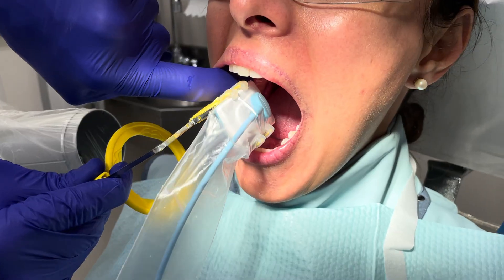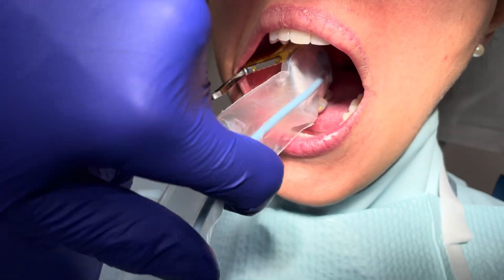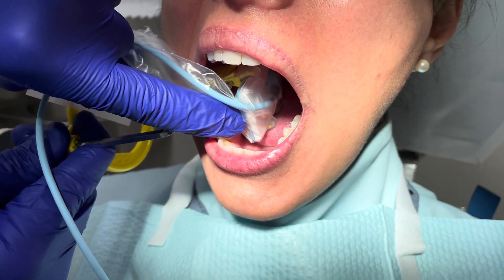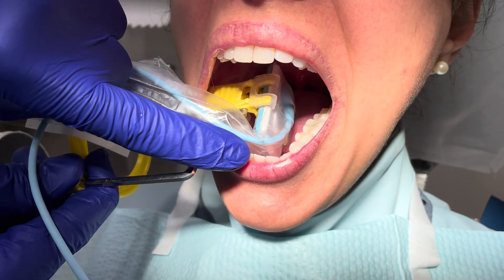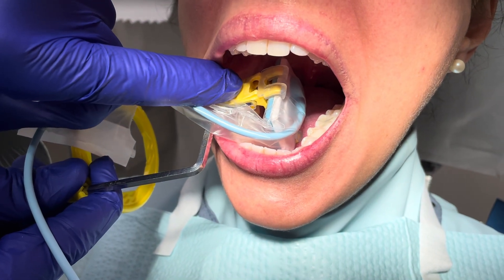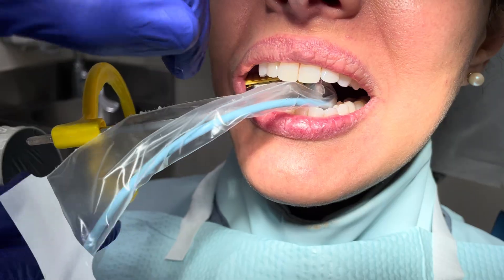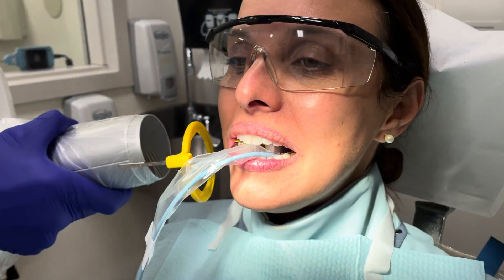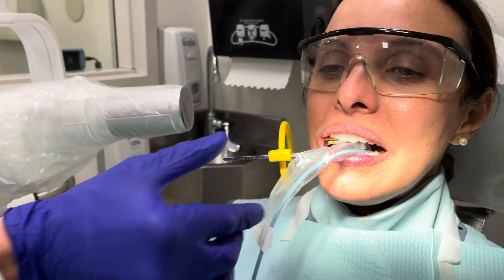This is how I do it: wide open cheek, deep in the mouth, pull on the cheek, get the cord out of the way, get that point right there, start angling it down, down, down. Bring it forward till the entire flat portion of the anterior hits her bone. Now, Maria, gently close down. Excellent. And line up.